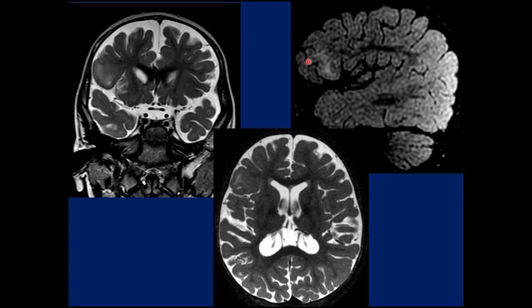So what are the anterior and the posterior limits of the resection? The anterior limit will be this sulcus. I would say this is the anterior horizontal ramus of the sylvian fissure. And the posterior limit is the ascending ramus of the sylvian fissure. So actually, this cortical dysplasia occupies the pars triangularis of the inferior frontal gyrus. And here we have the axial cut of the preoperative MRI.